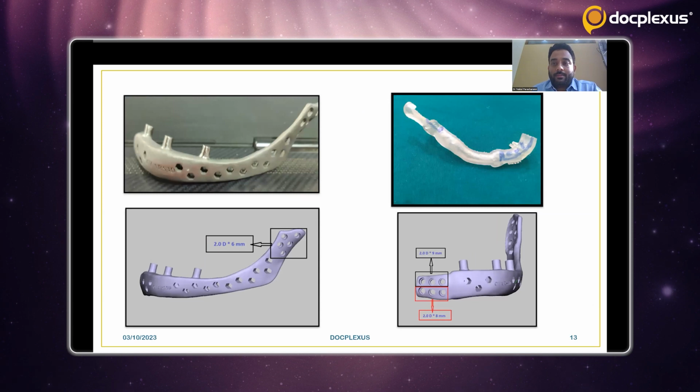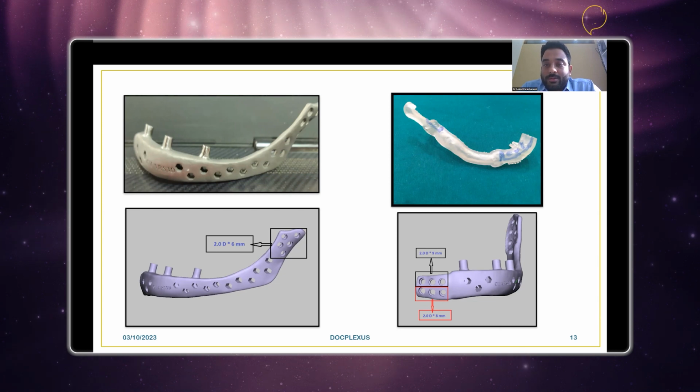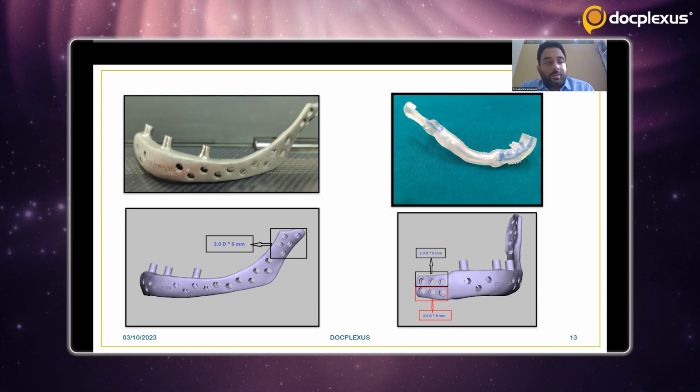So once the design was finalized, 3D printing was undertaken by the process called selective laser sintering, or layer by layer printing, that allows implants to be produced from associated design files. The prosthesis used in this case was made up of porous grade titanium aluminum Ti6Al4V metal. The surface, if you can see properly, was kept rough so as to aid adherence of tissues to the prosthesis.